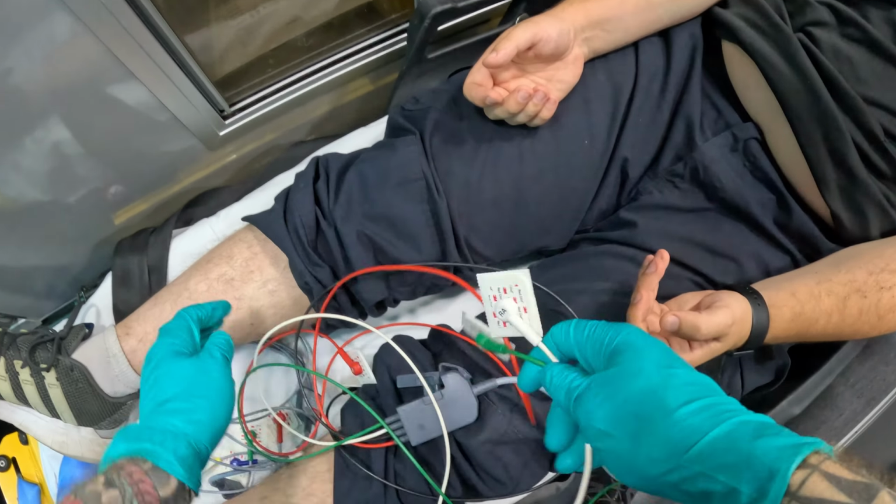From here, I could run my 3-lead. But I want to do a 12-lead, so I'll show you how I connect the precordial leads. This cable is only needed when you're doing a 12-lead. It's going to be connected into this part here, but before I connect it here, I want to place them on the patient first.